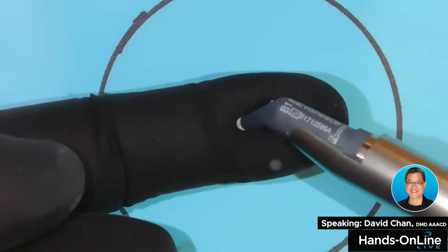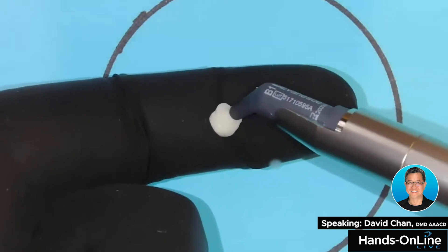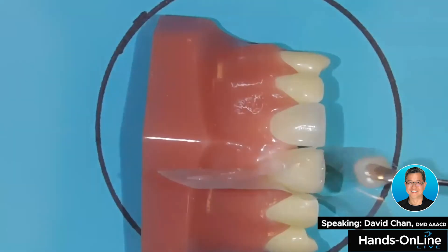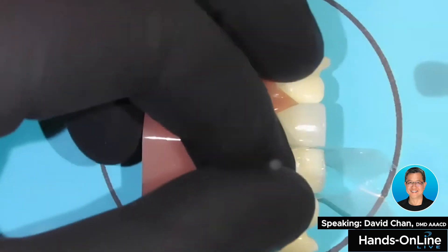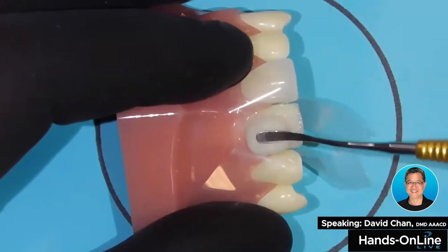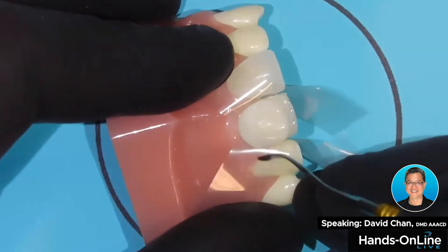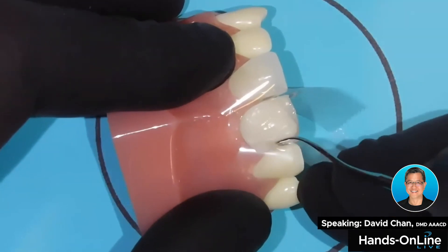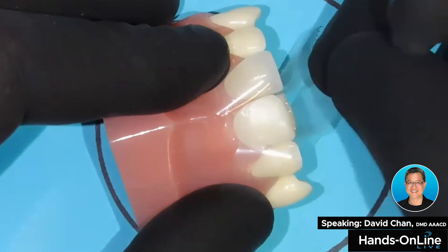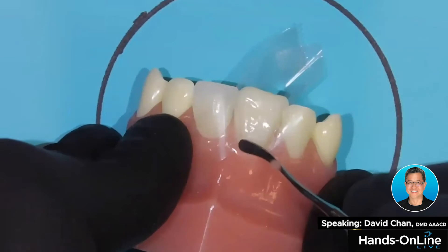I'm going to make a little ball here. I'm going to take it, and you see my tip never leaves the increment. And I put it on my spoon, and I open up the mylar, and I put it on here and adapt it. I force this material with this spoon into the proximal — I want it everywhere. You can even put your finger to help spread it initially, and you can adapt it cervically.